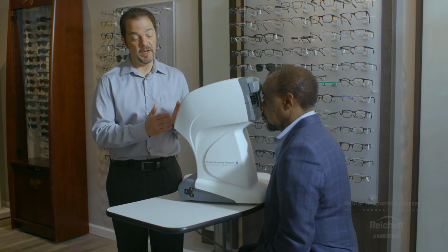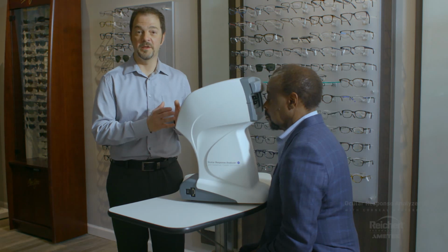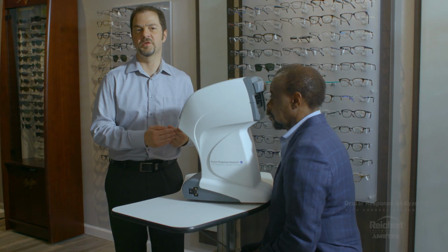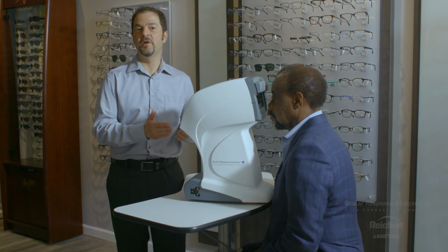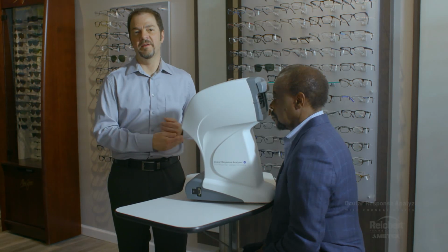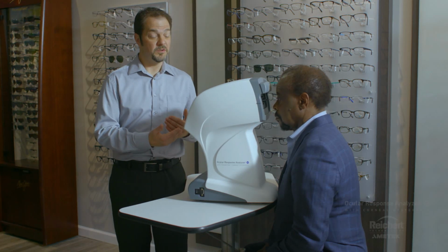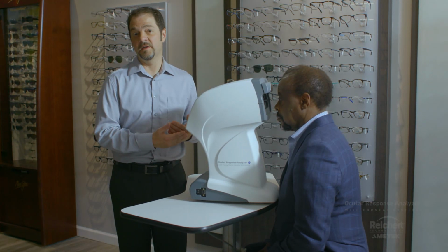The next thing I'll look at is the other numbers, the IOPs and the corneal hysteresis measurement, and I'll look for any asymmetry that might be concerning to me. Generally, when you get good waveform scores, the right and the left eye symmetry should be acceptable. If you see something that's concerning to you, it never hurts to take additional measurements.